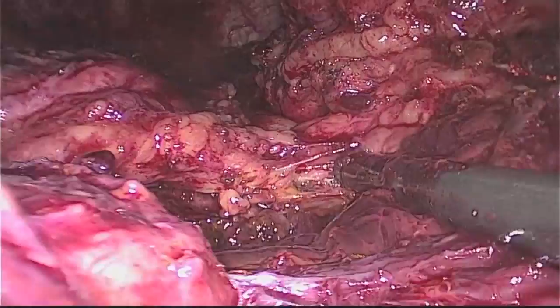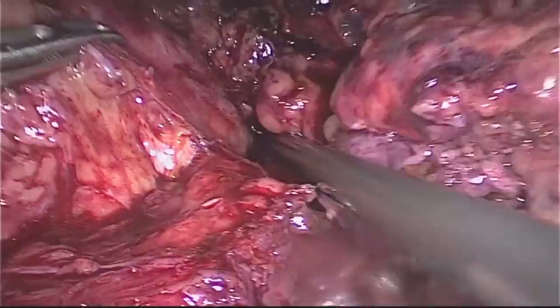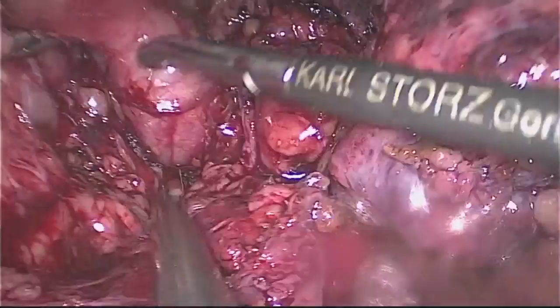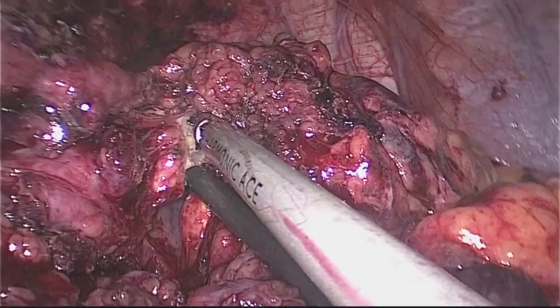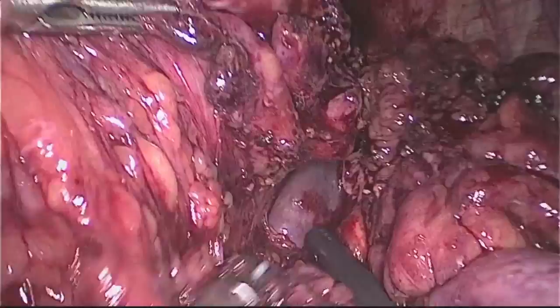An extensive dissection was then performed in order to identify and completely mobilize the sleeve from the pylorus up to the hiatus. We ensured that all adhesions were completely lysed that might have caused kinking or twisting of the sleeve, resulting in the stenosis.